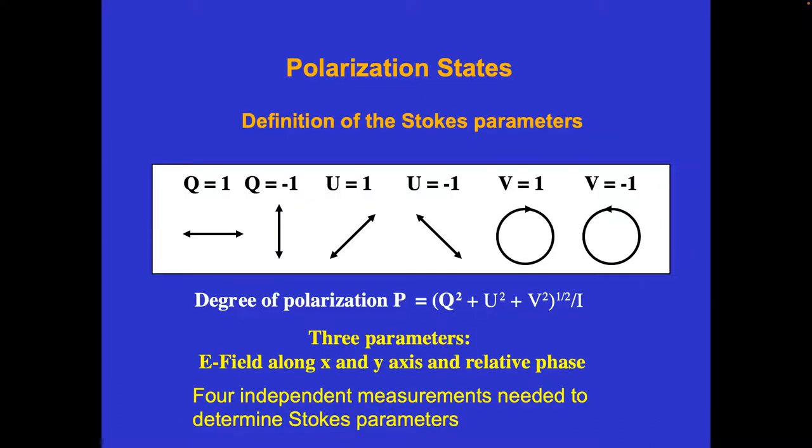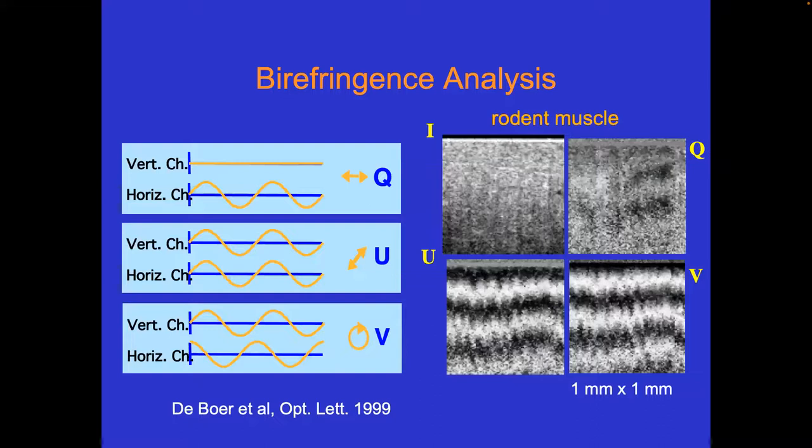I've got a very basic question. How do you measure the phase of light? It seems like a non-trivial task. It absolutely is. So this is a simplified picture. What I'm showing you is an interference pattern that I measure. The phase of one field you cannot measure. You can measure the relative phase between the sample and the reference arm. And that is what is shown here. The interference pattern shows the relative phase between the reference and sample. I cannot measure the absolute phase.